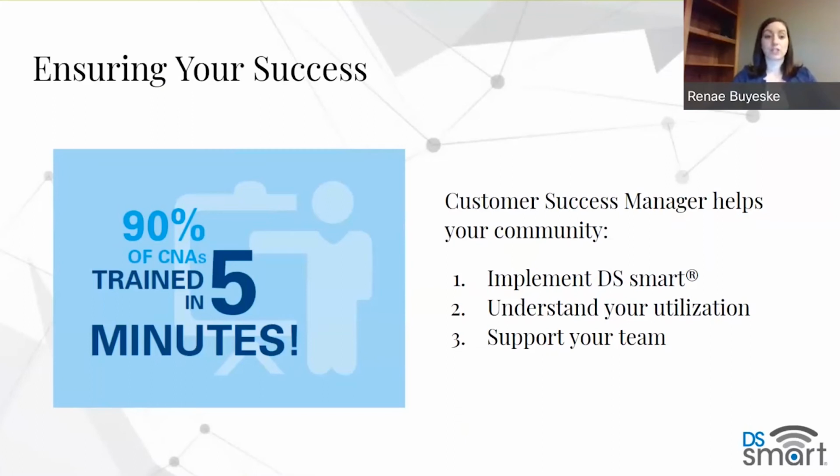That also includes free training. We have training through our learning management system that can be loaded right to the actual tablet itself. So training on board all the time for any of those nurses that need a refresher or anyone new that might be coming to the community and jumping in to do rounds for your residents. 90% of CNAs we have trained in 5 minutes or less. So again, something really quick and simple that they can learn very easily and get back on the floor and do what they need to do in order to grab that information and do the job for the day.